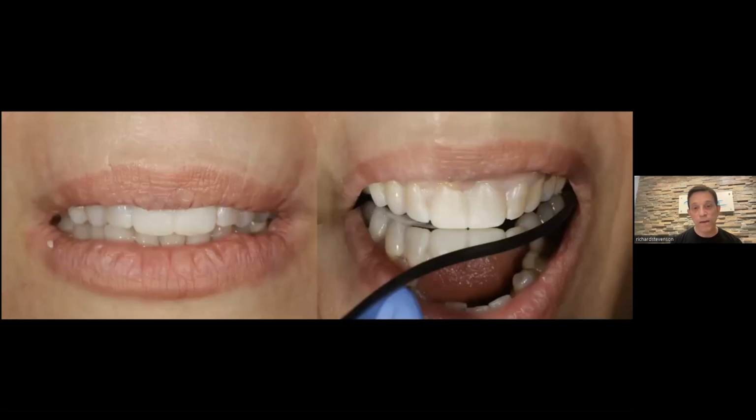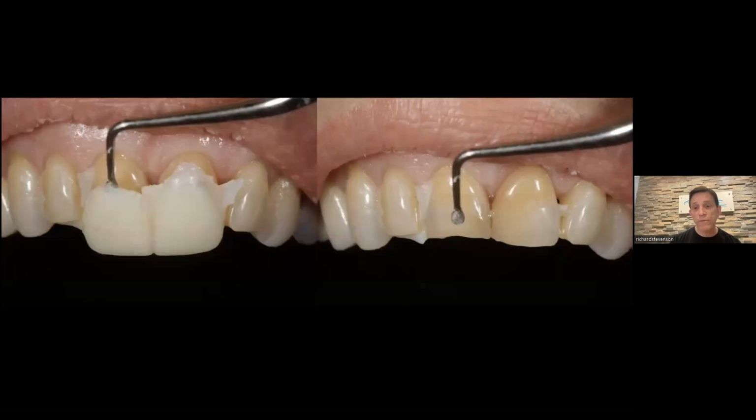Unfortunately, I placed a mirror in here to show you that the molars, the premolars, and the central incisors are all touching the mirror at the same time. So we have the laterals that are off the mirror, and all these are basically touching a flat surface. So we're getting a nice flat occlusal plane. Everything matches kind of nicely. And then we just peel it off and we say, okay, that's what we might have it look like. We don't bond it on. I don't like patients walking out with this thing.